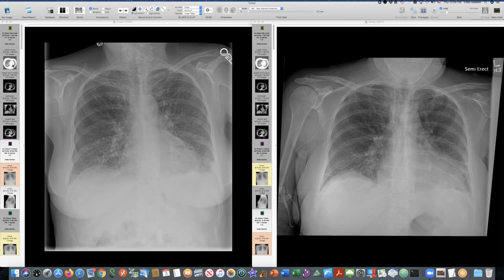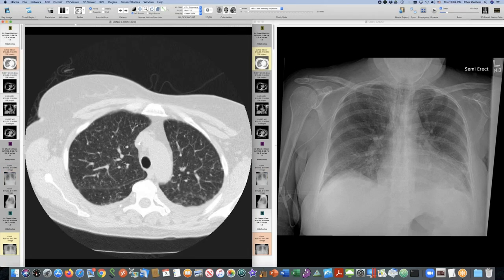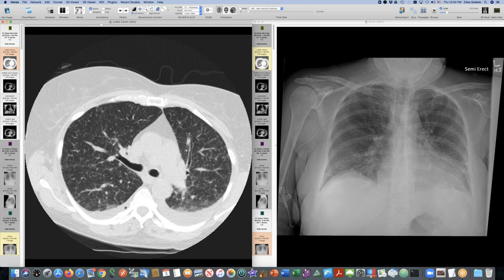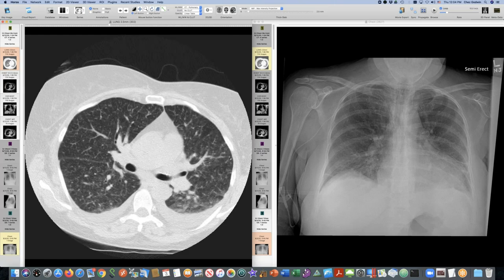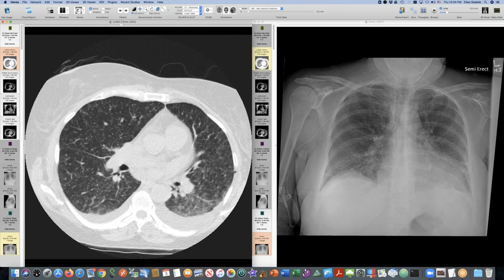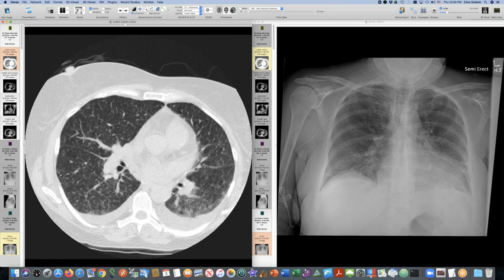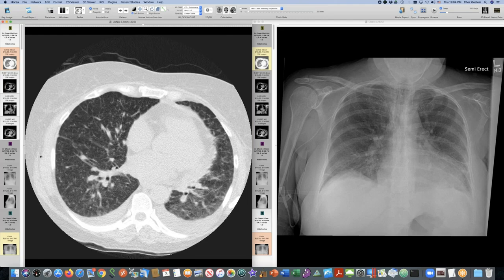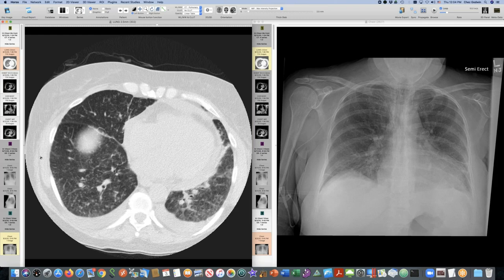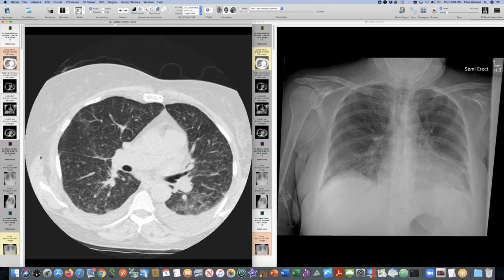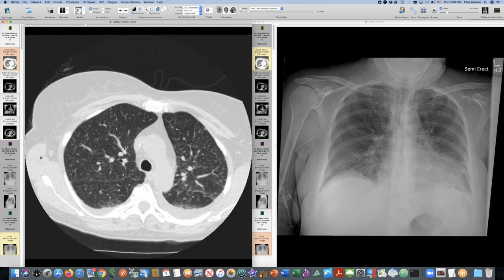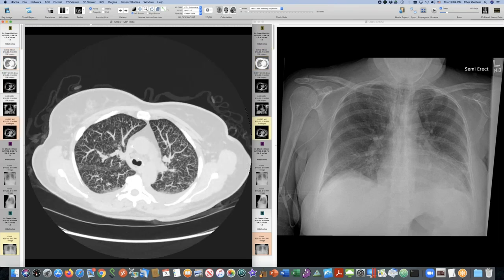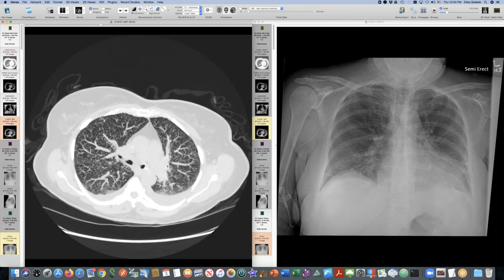This is what CT looked like the next day. It turns out there is a ton of very small nodules. Some of them are immediately subpleural, and some of them are along the fissures here. So this would be a miliary pattern implying bloodborne dissemination of some infection. At the same time, she had skin lesions, and the skin lesions were biopsied. Let me show you what the MIPs look like here, because it does help to bring this pattern out of these very small nodules.